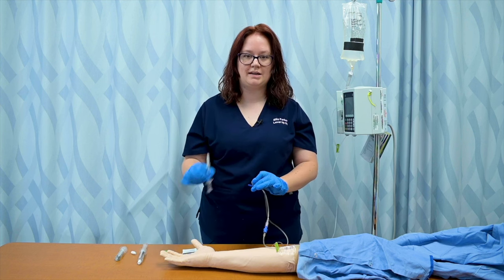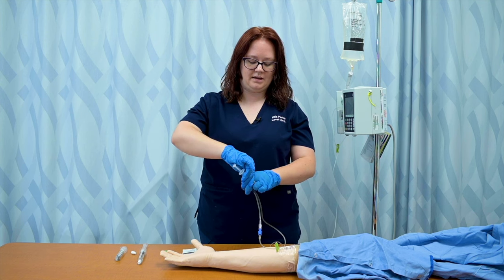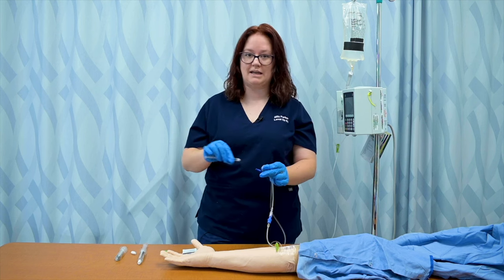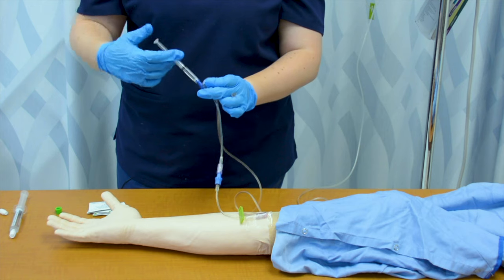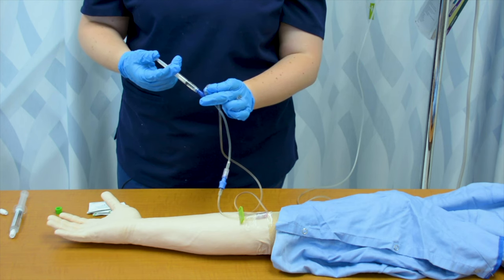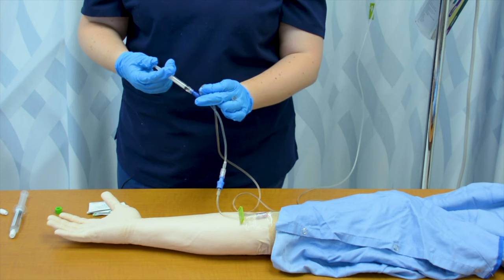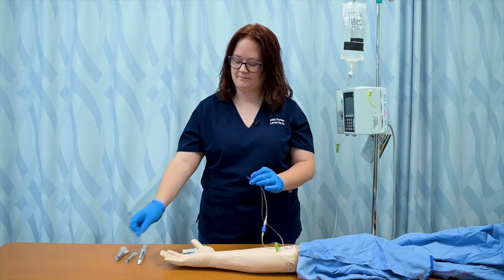Next, I'll go ahead and administer this medication. So I've already drawn it up. And unless I drop this and it becomes contaminated, I can just keep attaching syringes to it. So I'll attach this syringe and I'll push this medication at the recommended rate for that medication, which you may need to look up in a drug book or contact pharmacy to receive. So I'm pushing it at the recommended rate. I can then remove that syringe.